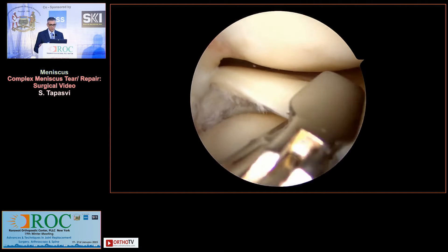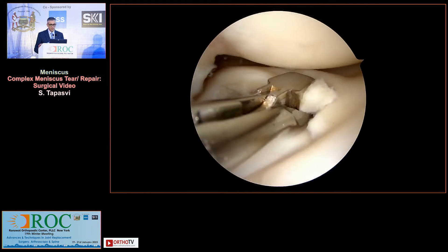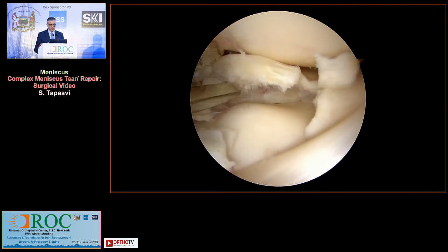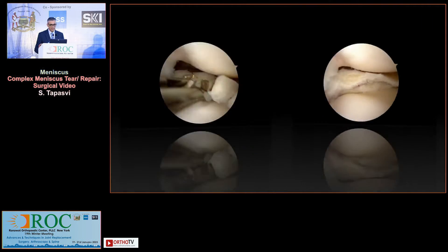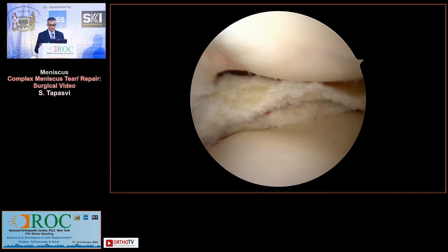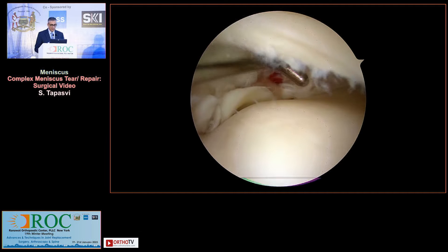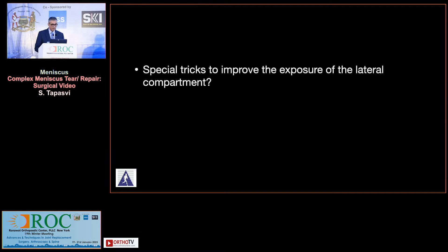This is her arthroscopic view. She's essentially got a discoid lateral meniscus — an incomplete type of discoid lateral meniscus — and this is detached on the posterior aspect. After a bit of trimming and saucerization, the question is that this is a lateral discoid meniscus with a complex tear, and it deserves surgical treatment.